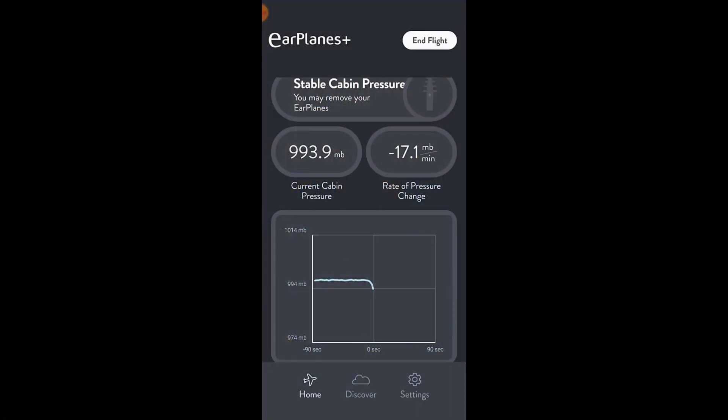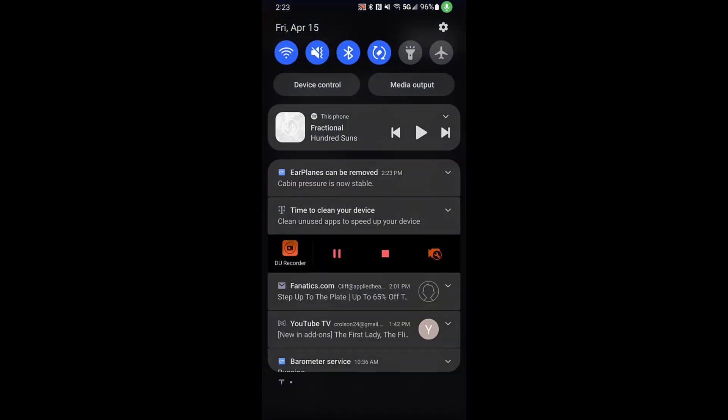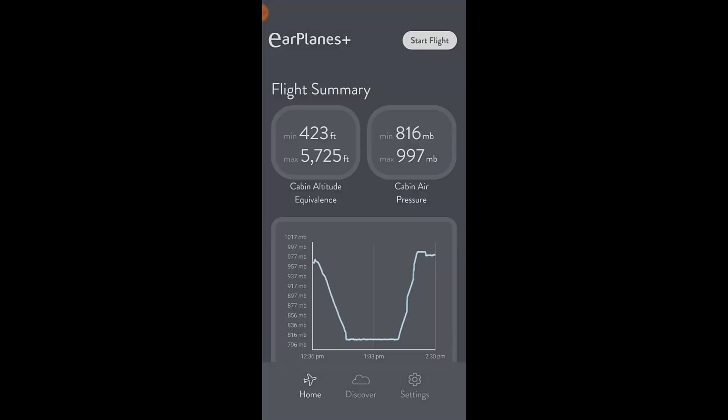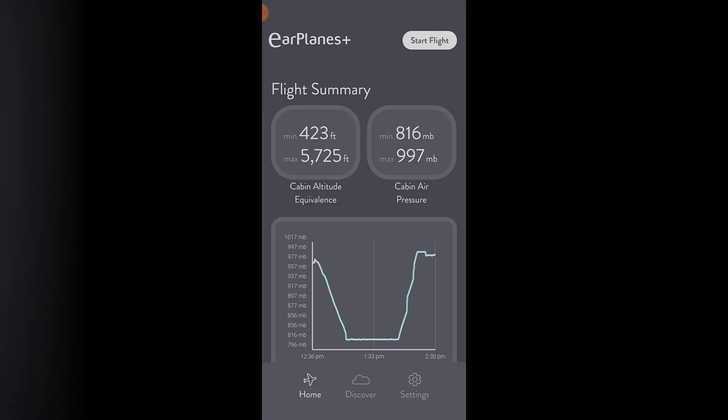Perhaps the coolest thing about the EarPlanes earplugs is that they actually have a smartphone app that will tell you when to put them in your ears and when it's safe to take them out, because it uses your phone's internal pressure gauge to determine if you're having rapid pressure changes. I found it incredibly helpful to receive notifications on when to insert and remove the earplugs, and also fascinating to see how quickly the cabin air pressure and elevation was changing during takeoff and landing.